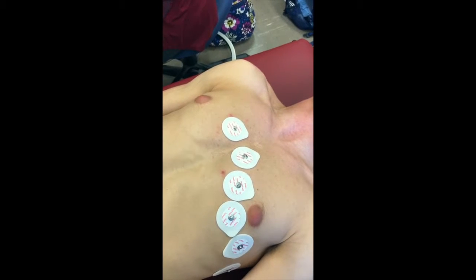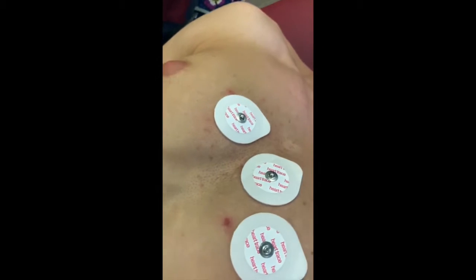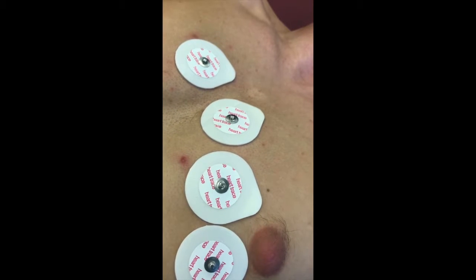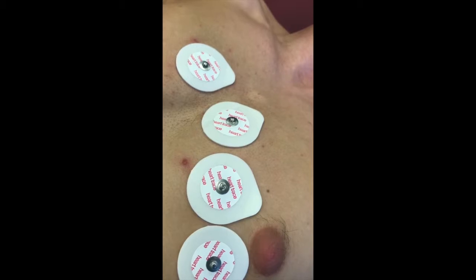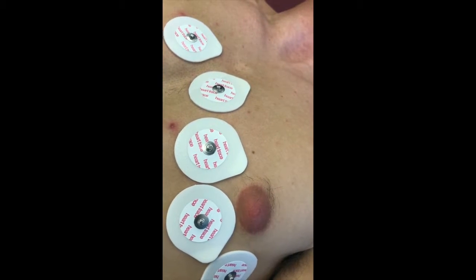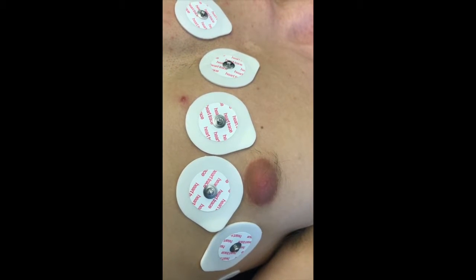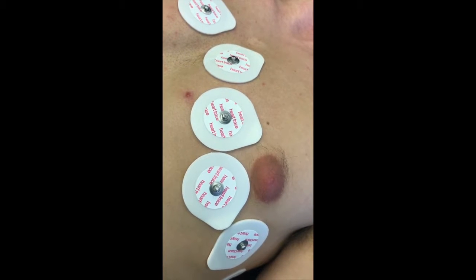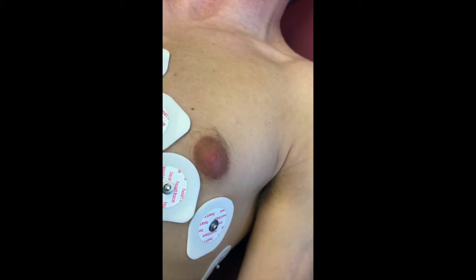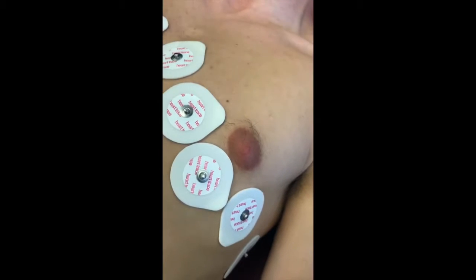After cleaning all of the areas, this is the location of the six chest leads. V1 is in the 4th intercostal space. V2 is in the 4th intercostal space left of the sternum. V3 is the linear midpoint between V2 and V4. V4 is in the 5th intercostal space at the midclavicular line.